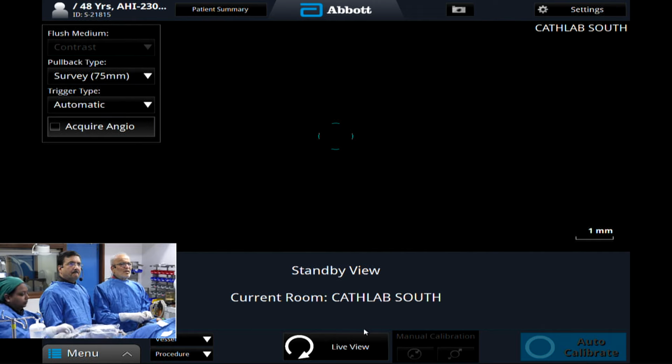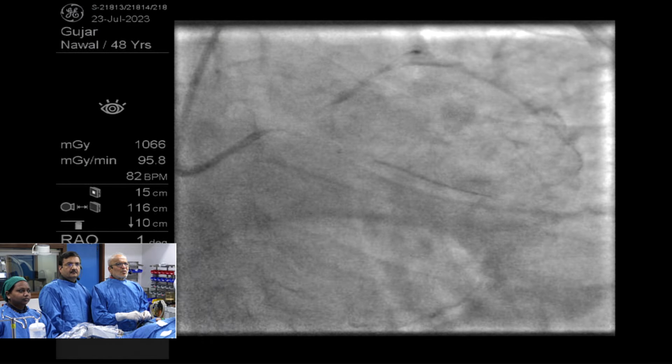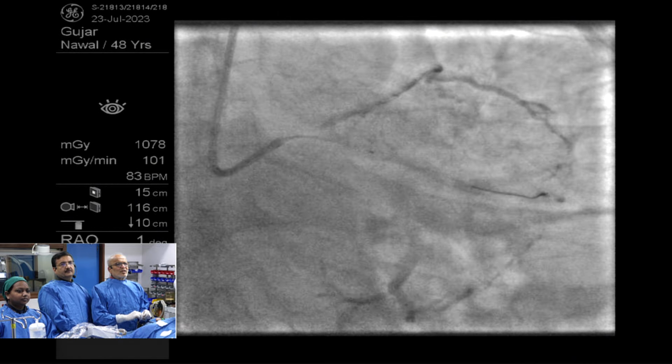I am a little careful about pushing my distal tip. Show me the distal tip. Oh no, I have to come out. No, wire push. Just show me. Can we see the fluoro screen? Yes, thank you. This is better. Okay. Yes.